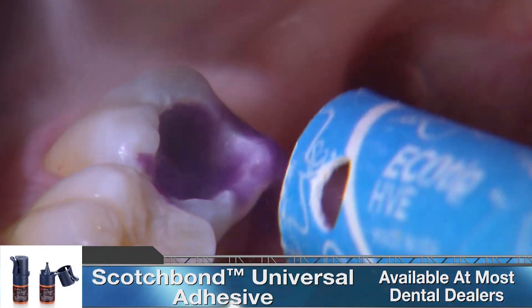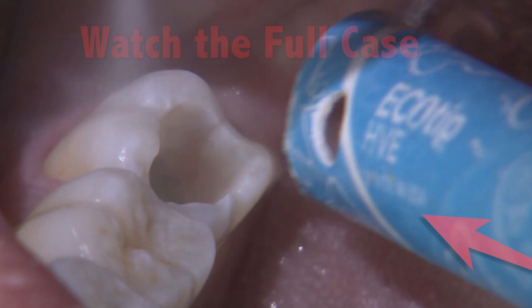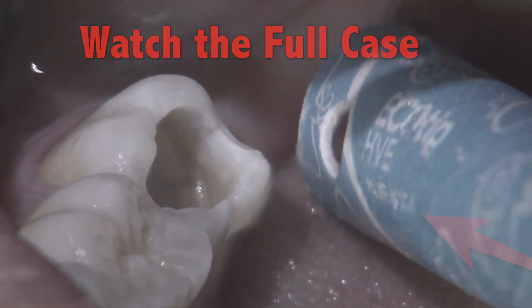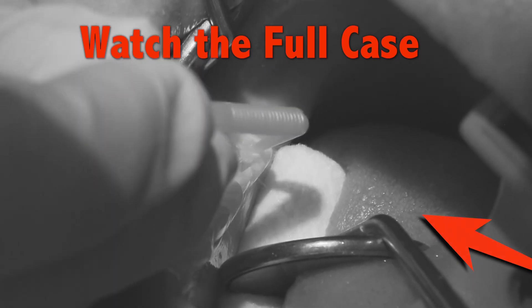Always use a gentle stream of oil-free air after applying the adhesive until it stops moving. This will ensure that the solvents have fully evaporated and a maximum bond can be achieved.